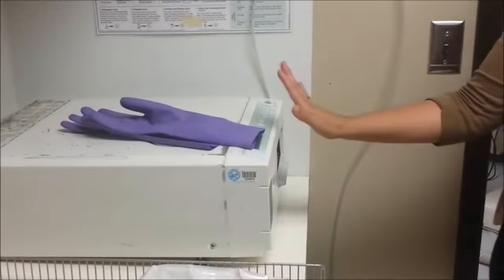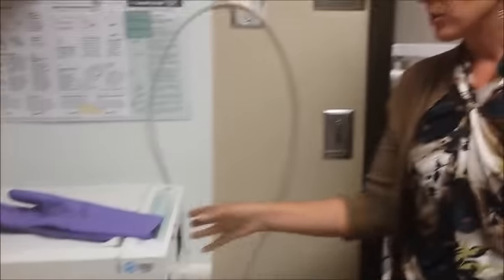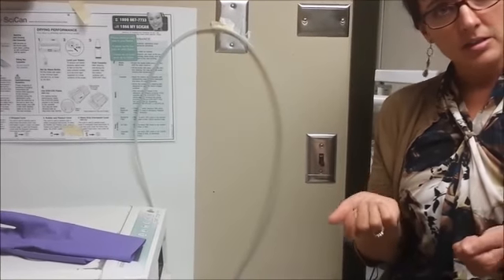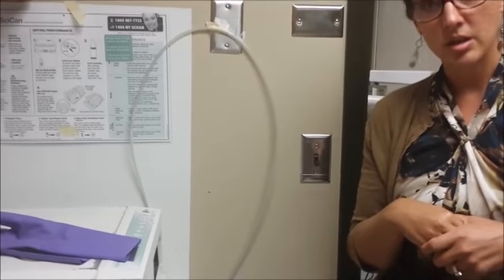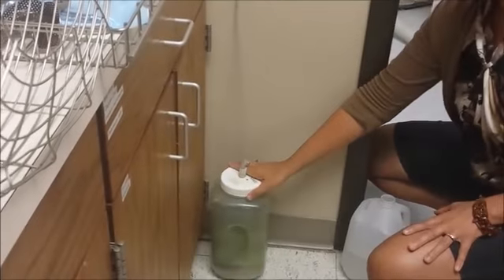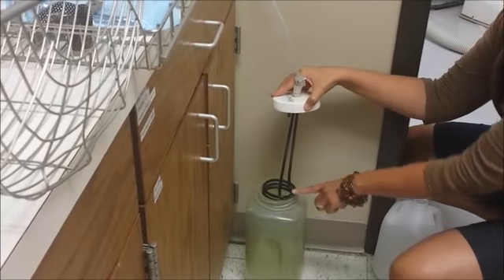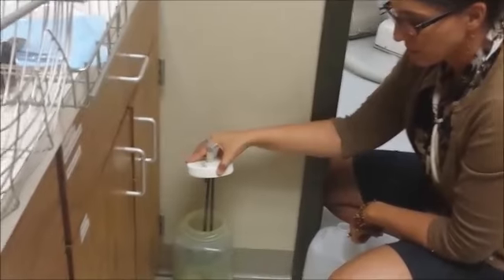Safety hazards for the Statim: the autoclave uses really high heat, so when you're taking out the cassette and opening it, be aware that there could be some steam released. The contents within the Statim might also be very hot to the touch, so be careful not to burn yourself. When emptying or refilling the waste bottle, the heating element and the water inside can be very hot — so again, be careful with the hot temperatures.